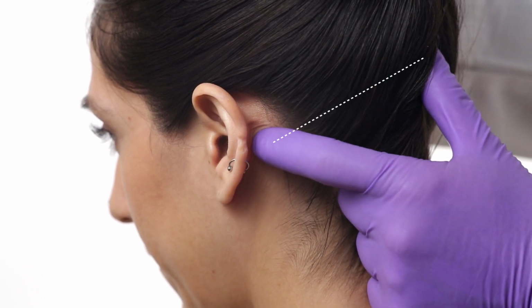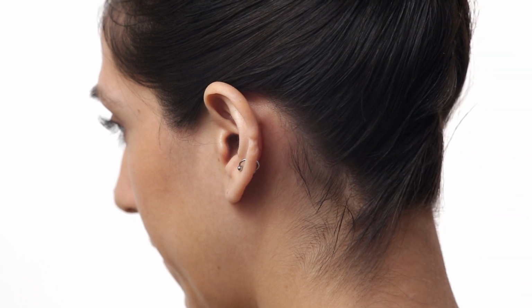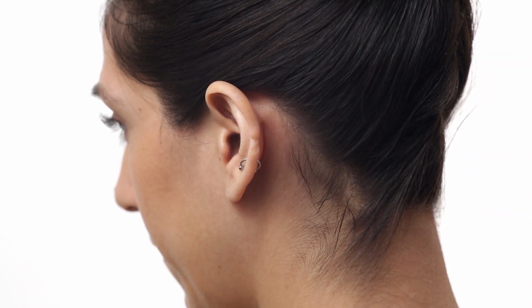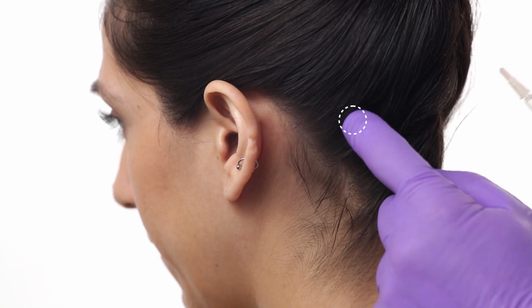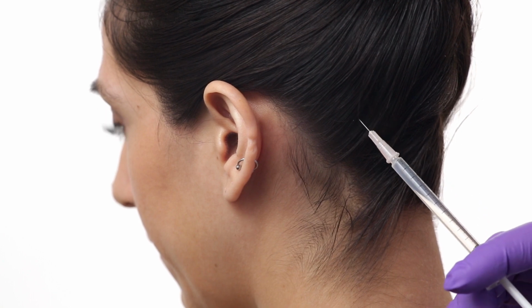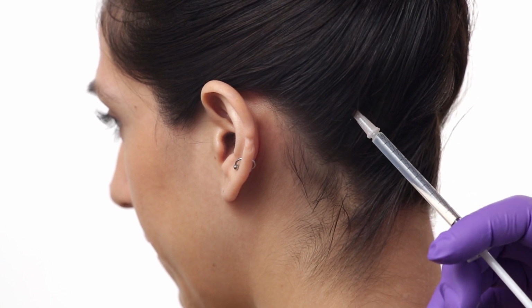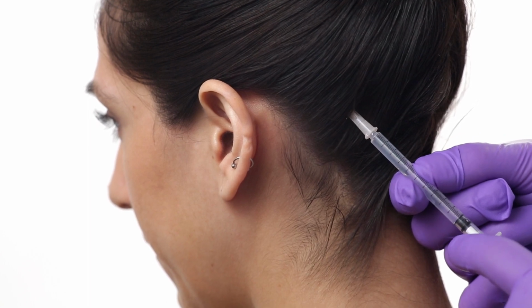Divide the space between your thumb and index finger in half. The first injection site is just above the nuchal ridge at this midpoint. Remember to avoid any bony structure. Before injecting, make sure the bevel of the needle is facing up and that the needle is on a 45-degree angle, to avoid injecting any additional Botox into the neck region.